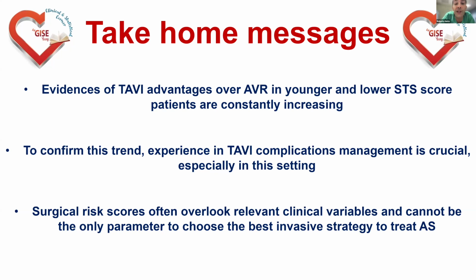And regarding patient prosthesis mismatch, yes, you have to deal with it, especially for the long-term results, for the durability. That's why I emphasize the dimension of the annulus, which in this case was large, so no worries about the use of a balloon expandable valve.